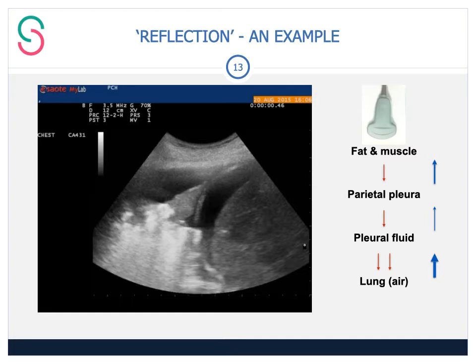this little video clip of a small pleural effusion with the lung, the diaphragm to the right, and the liver, and also some fluid underneath the diaphragm, in this case ascites. And you can see, for example, the sound transmission comes from the probe contact with the skin, passes through subcutaneous tissue and muscle. It hits the parietal pleura, and then there's some reflection back to the transducer.